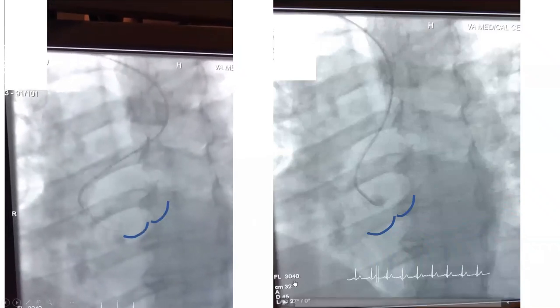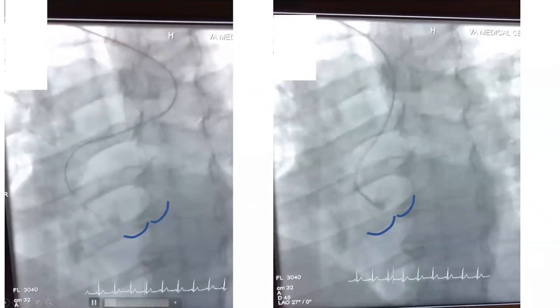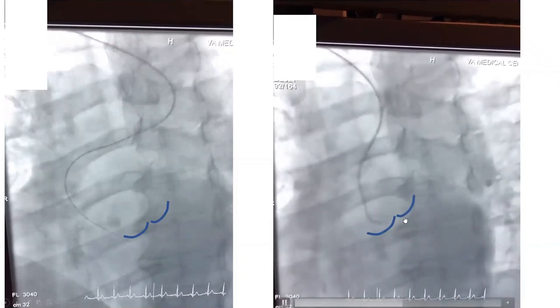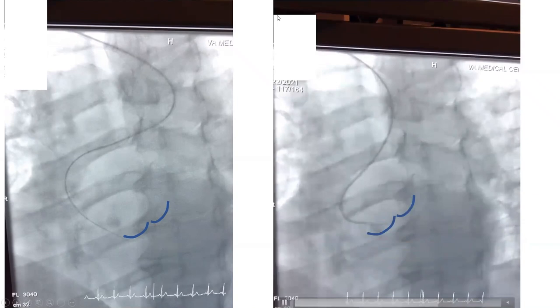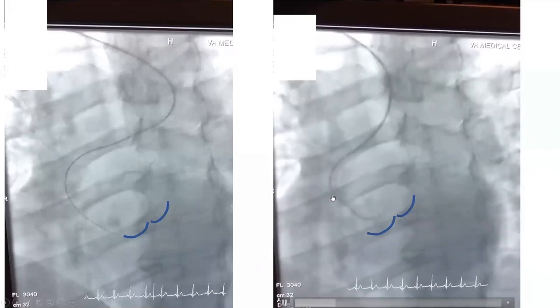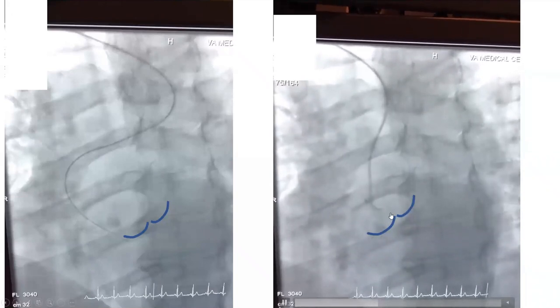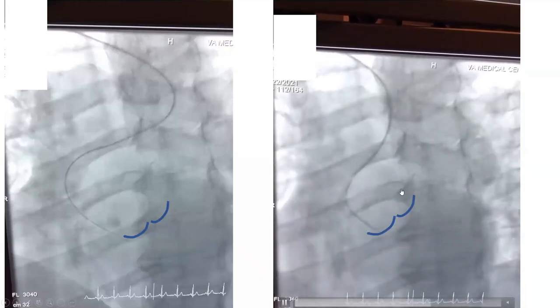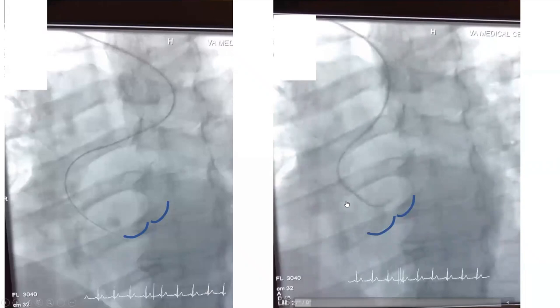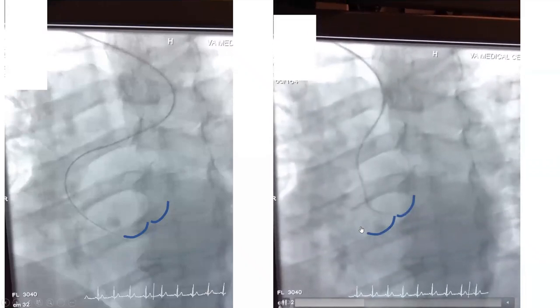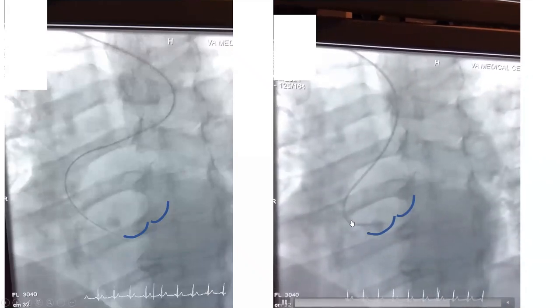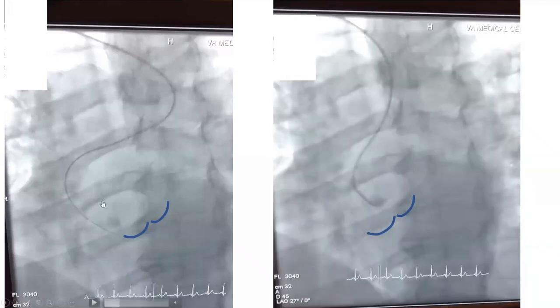Now we have to get to the left cusp and try to engage. We tried to jump in the left cusp, but every time we tried, the whole catheter jumped out. So we did something unusual but useful in extreme cases: we tried to loop from the right cusp. I failed to make it jump, so I just pushed it from the right cusp and we were able to get a very stable engagement with very good pictures. I used a six French JL3.5 in this case. Another option would have been Ikari left 3.75 or 4.